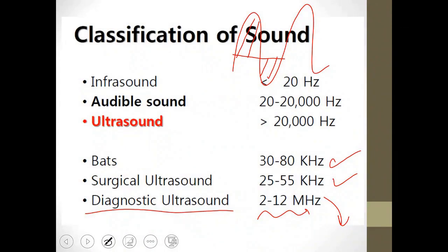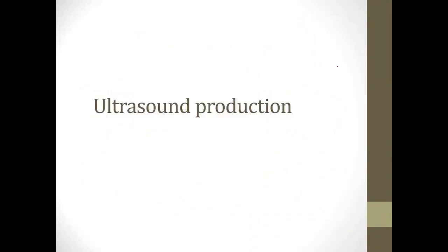We have a certain range of frequencies that we can hear. Even some sounds in nature are inaudible to us because they have frequencies outside the range that humans can perceive. Humans can hear certain frequencies. So this is the frequency I am working with, which is in diagnostic ultrasound, representing the number of cycles per second. Now, I was just talking about the probe. The probe, as you all know, has its applications, whether it is a convex probe, linear probe, or sector probe. We will also discuss in a lecture about the probes, their applications, and how their construction works internally.